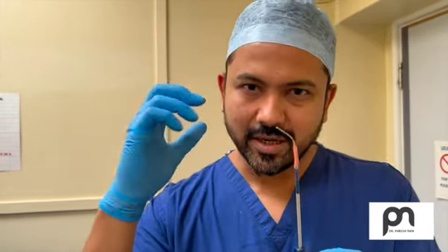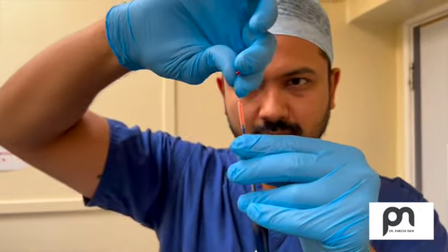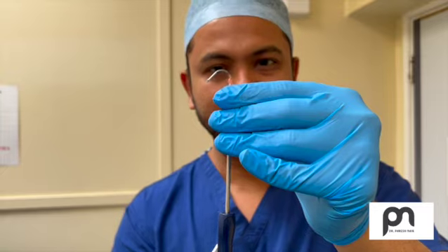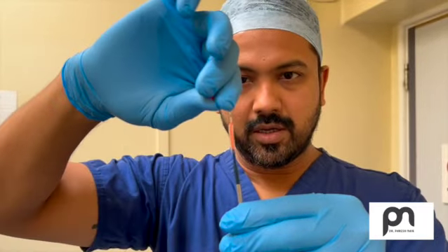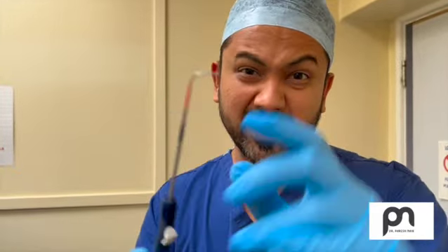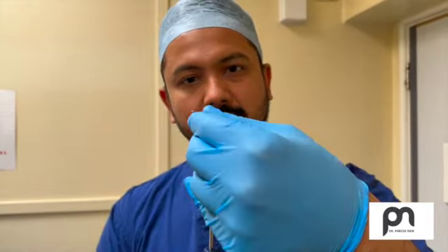Why do we need that? Because just imagine, where is the maxillary sinus ostium placed? Where is the frontal sinus ostium placed? Everyone has its own angulation, and the sphenoid ostium is straight. So this can change, okay? This is how the maxillary sinus ostium will be. If you go slightly more curved this way, there's a mold, you just have to fix it and change it. This will be the frontal sinus ostium, and something like this will be for the eustachian tube.